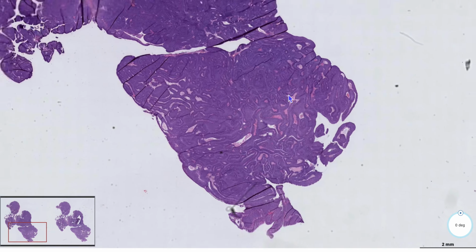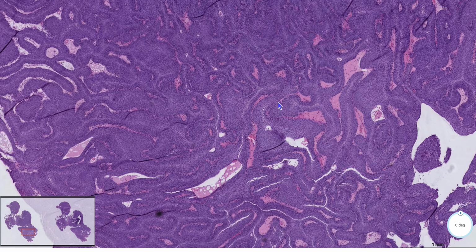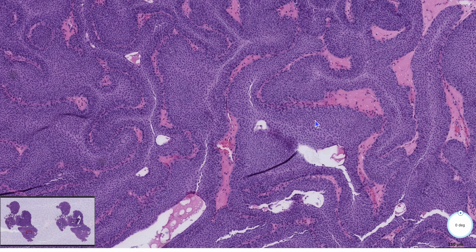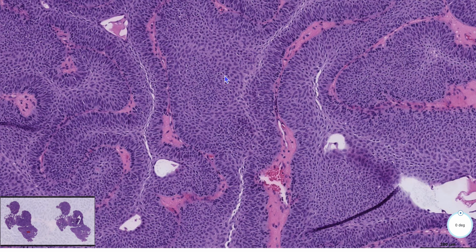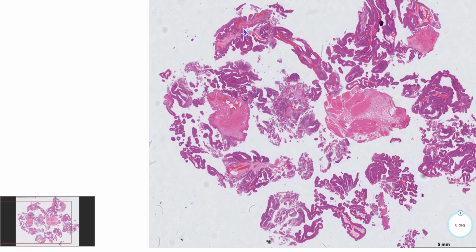And just to recap, you're going to see anastomosing cords of urothelium. They're going to have some palisading of the basal layer. And they're going to have a proliferation of the urothelium, but they should not have any mitoses. They can be a little bit spindled. There can be a little bit of reactive changes, but there will be retained polarity. Inverted papilloma. Now let's go here.